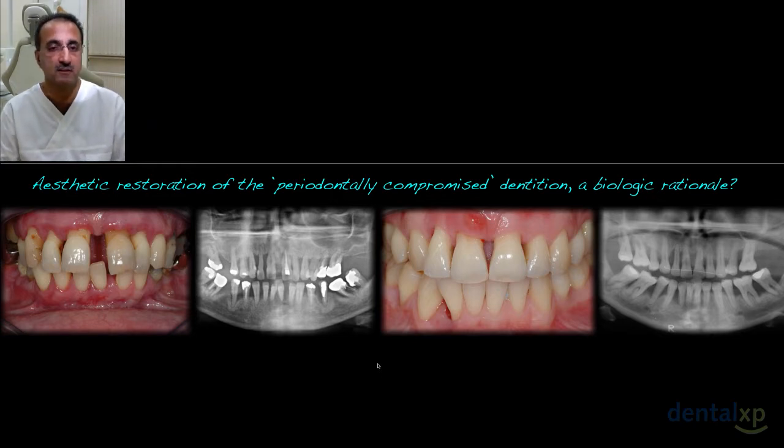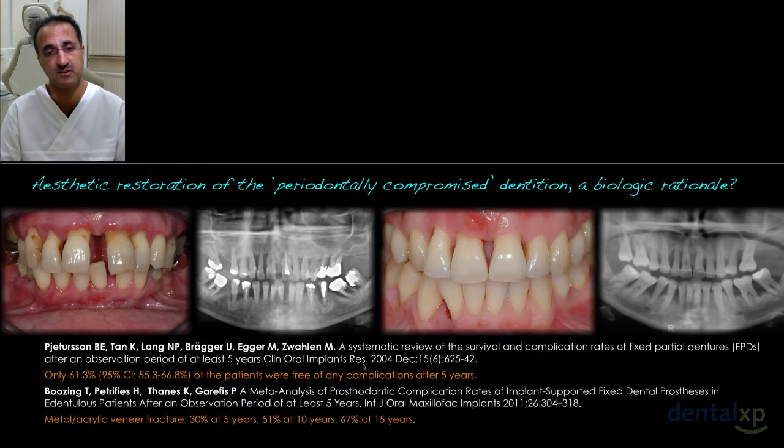We also know that these large one-piece frameworks, if we look at the systematic reviews, certainly there tends to be a higher rate of complications and chipping or fracture or delamination of the veneering materials from these, whether it's acrylic or ceramic.